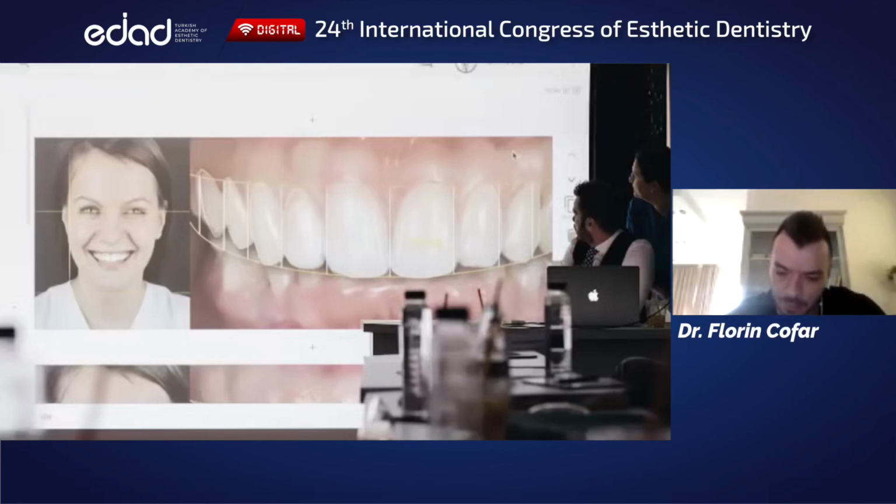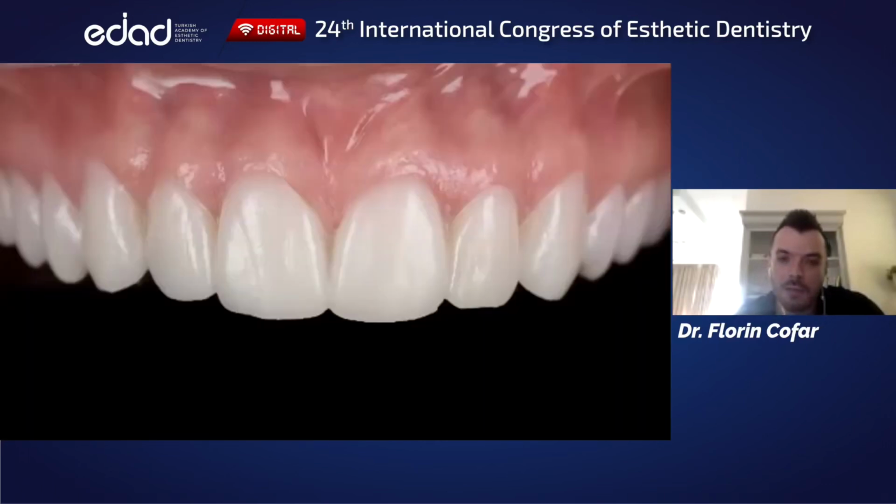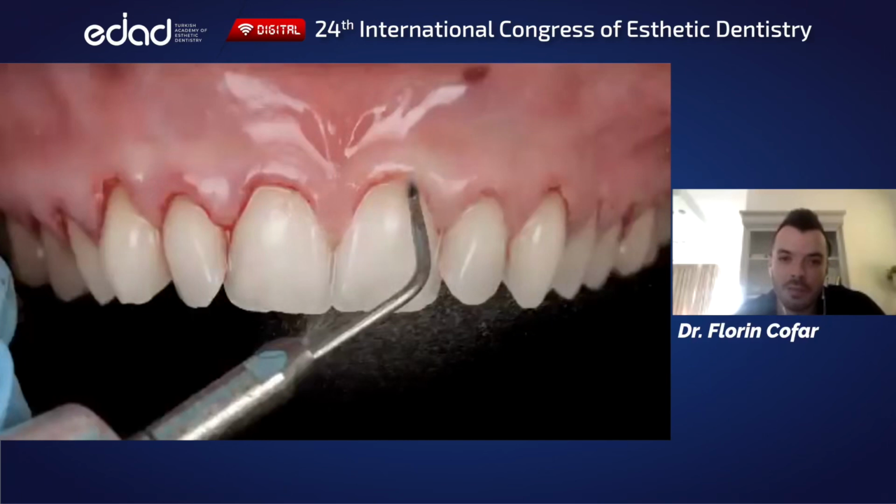Now, every case has the same narrative: you have a planning phase with some stages, which I will cover immediately. As you can see here, in the planning phase you have a 2D phase where you select the library according to the face. Then you have the phase where you transfer this into the mouth in the form of a motivational mock-up. Then the goal of the dentist is to simply follow that design in a way that the lab has all the conditions to actually copy those shapes.